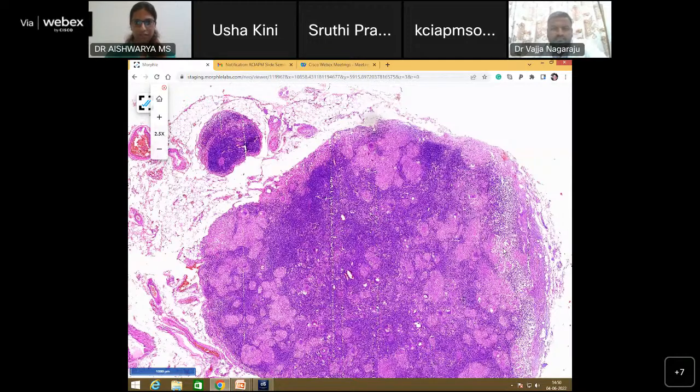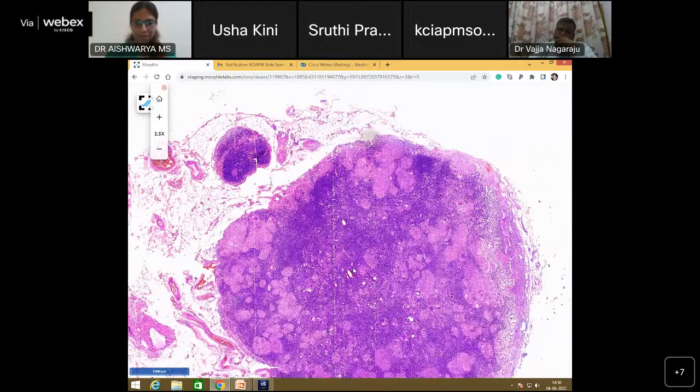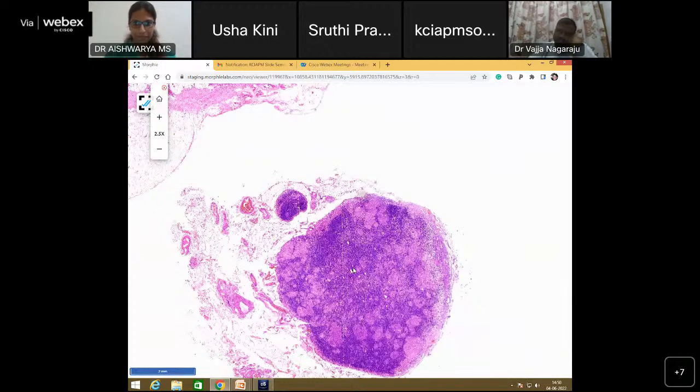And the follicle germinal centers that you want to see all depend on how much it is being stimulated. So I feel here we have a lesion in these three lymph nodes. And believe it or not, even this little fellow, so small, is also having a granuloma, right? And this one, is it a lymph node?